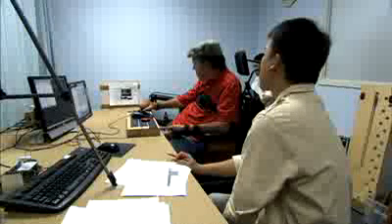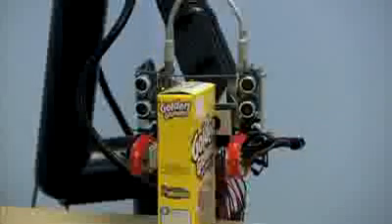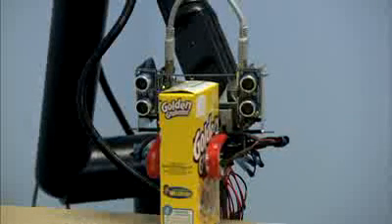During the research, Del and other study participants worked with the UCF and Orlando Health teams to evaluate two types of software, Cartesian mode and auto mode. One is a mode where the subject has to control each movement. Move the arm forward, stop. Move it left, stop. Turn the wrist clockwise, stop.